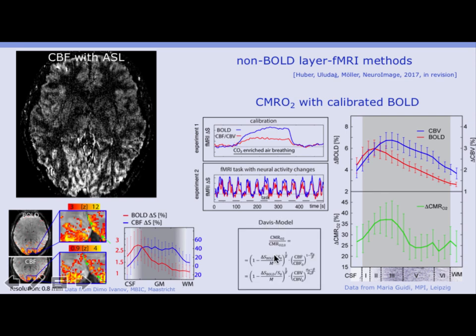And you also have quite a few biophysical model assumptions underlying that to get to these CMRO2 results, and they still need to be validated across cortical layers.